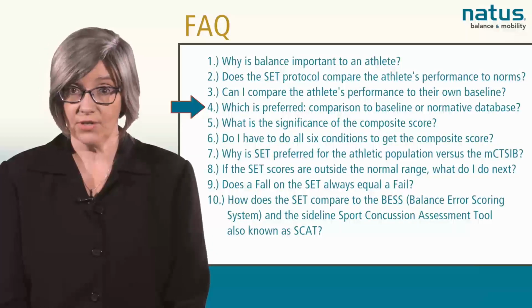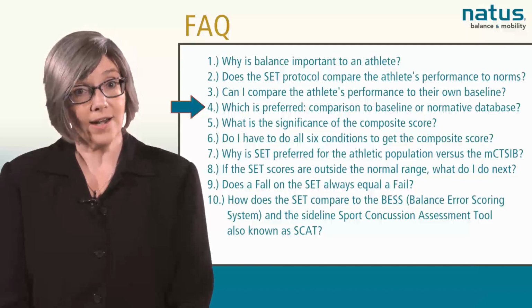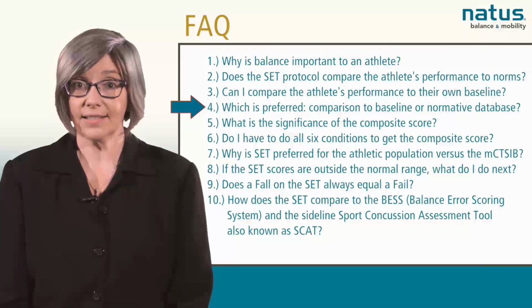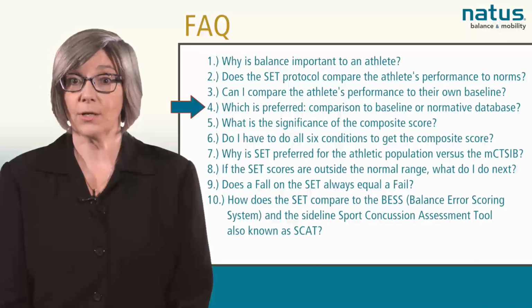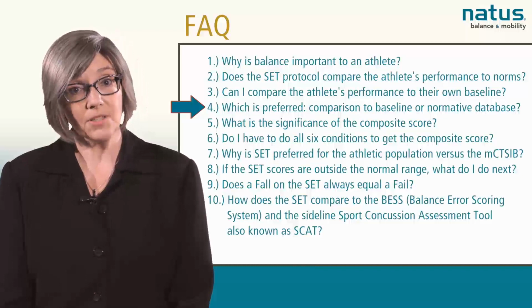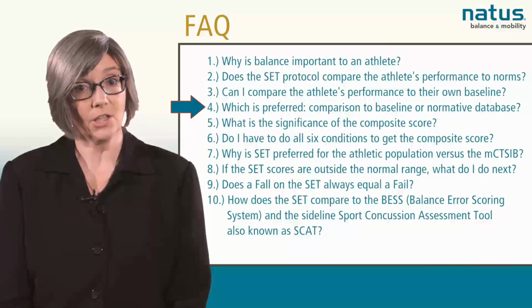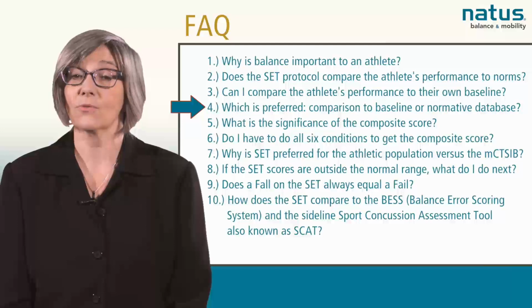If, after an injury, the athlete's SET protocol scores are normal or as good as their peers in the reference data set, but not as good as their baseline performance, they likely still have a problem. It is recommended that the athlete return to their baseline scores before returning to play. It is up to the clinical judgment of the athletic trainer to evaluate the total clinical picture and determine if, along with neurocognitive and symptom information, the athlete is ready to return to play.